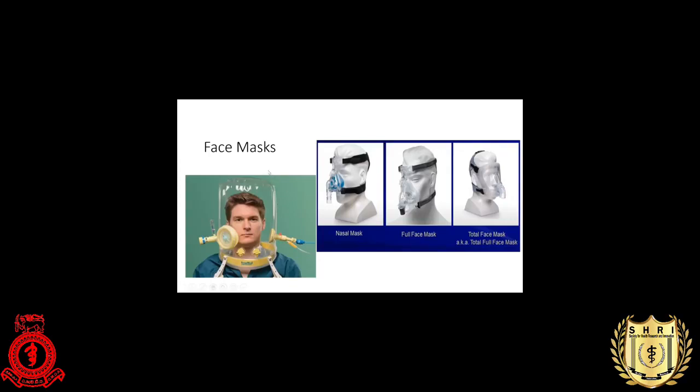These are the interfaces that we use to deliver non-invasive positive pressure ventilation to the patient. We can use a nasal mask, usually helpful in patients with obstructive sleep apnea. And this is a full face mask. This is what you call a total face mask. This is the CPAP helmet. Each carries its own advantages and disadvantages. I think the helmet is not available in Sri Lanka.